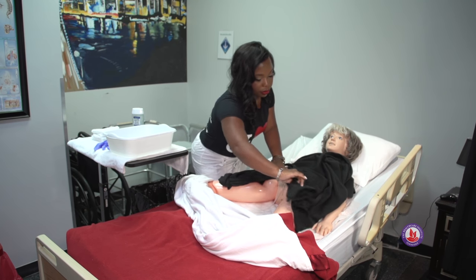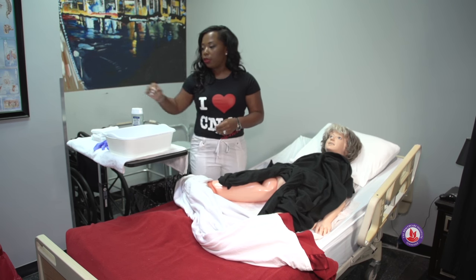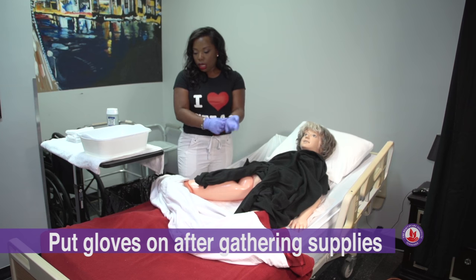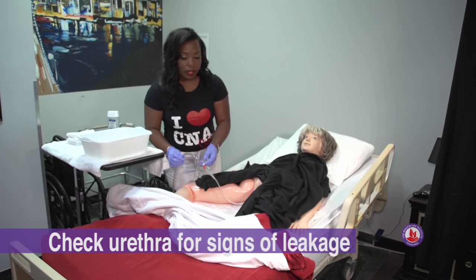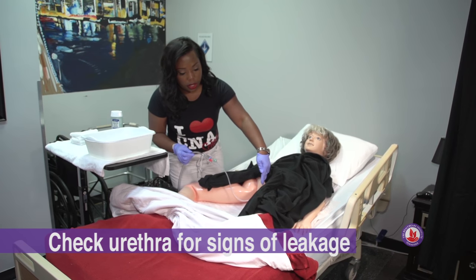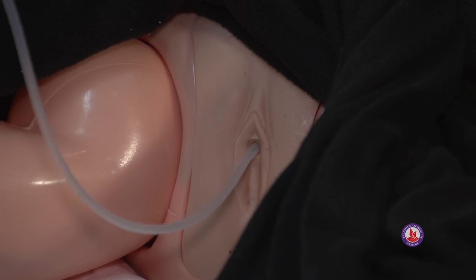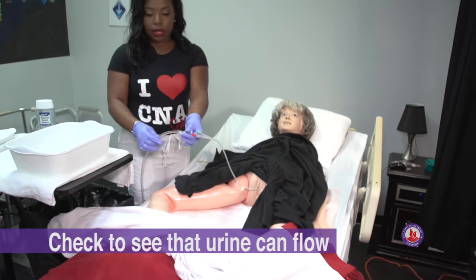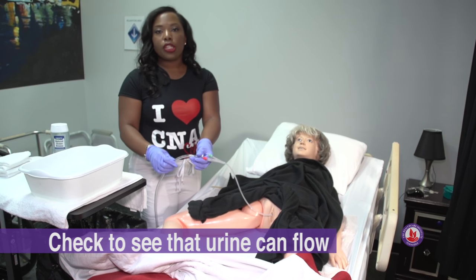That's the catheter. Now that we've got the area prepped, we can put our gloves on. This skill also requires that we verbalize a few things. We want to make sure there's no leakage around the urethra. After we verbalize that there is no leakage around the urethra, we want to also check for kinks in the tubing. There are no kinks in the tubing, and urine can flow freely into the drainage bag.